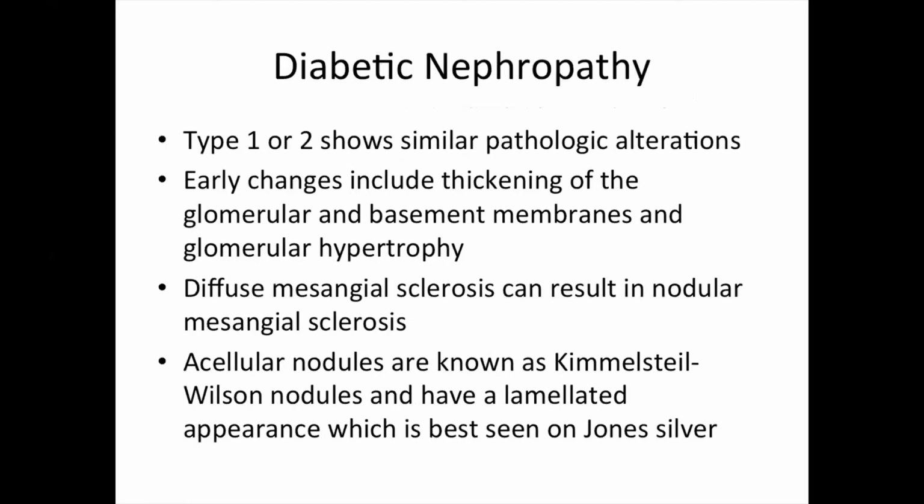I just want to make sure the immunofluorescence point is clear. Did you guys get what I was saying about the immunofluorescence? About it being basically accentuating, highlighting the glomerular basement membrane and the tubular basement membrane rather than being truly positive. Yeah, okay, brilliant.